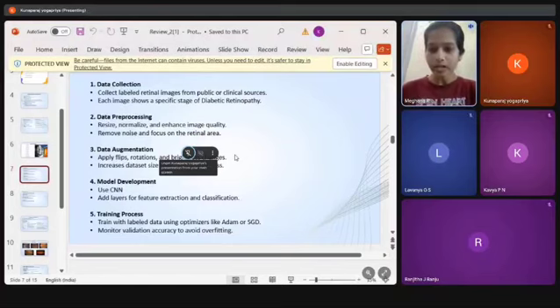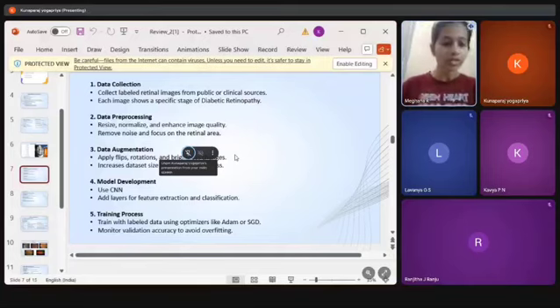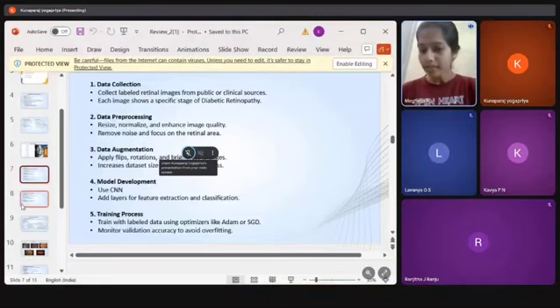Here we use a convolutional neural network due to its excellence in image tasks. The fifth step is the training process. The model is trained using the training dataset with labels, over multiple epochs, adjusting batch size and learning rate. For example, if we consider a batch size of 100 and 1,000 training examples, one epoch is when it goes through all 1,000 training examples.